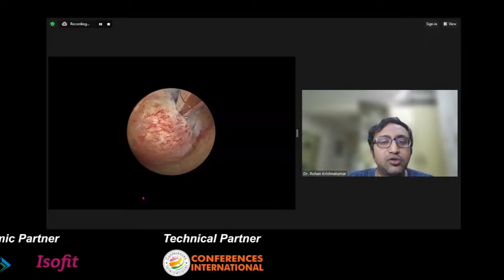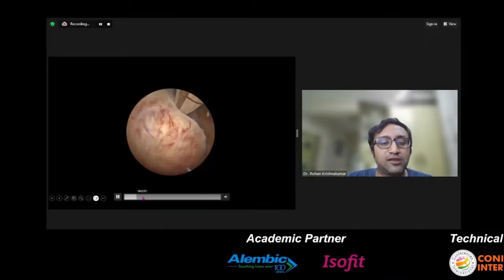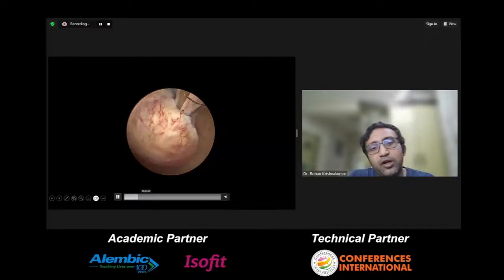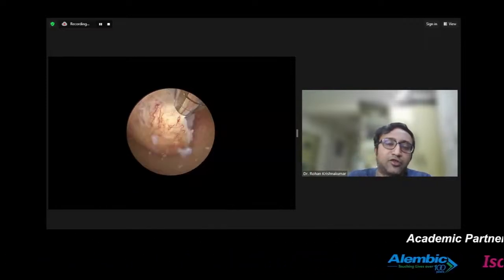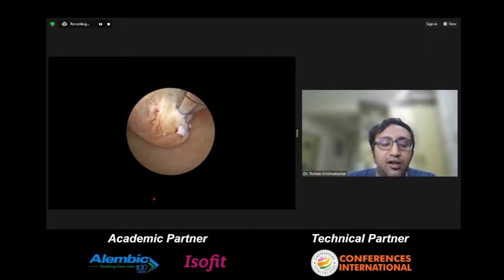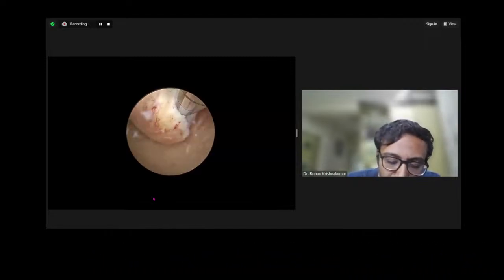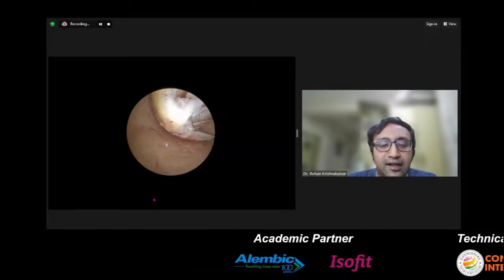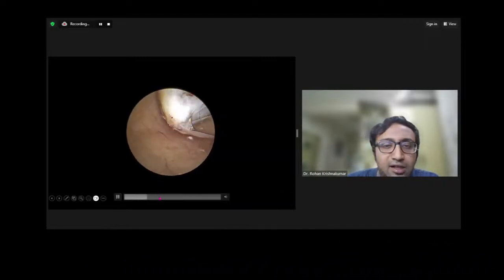We didn't have to use a diagnostic scope first; our ultrasound scan was enough. We could directly use this 6.5 instrument. With the scope as well as the morcellator, the insert is 3 mm. You also get 3 mm graspers and scissors in case you want to use them. But you can directly enter through this without dilating, just bloodless.